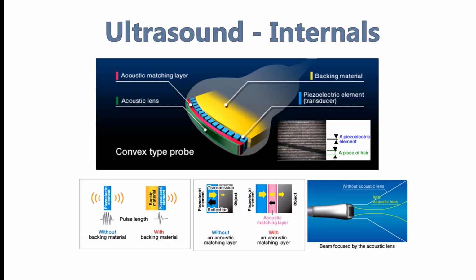The matching layers lie between the acoustic array and the lens and commonly consist of several different types of material. The thickness is generally a quarter of the wavelength of the array's center frequency. The purpose is to maximize transmission of energy from the acoustic array to tissue by reducing reflection and increasing the amount of frequencies emitted by the probe.